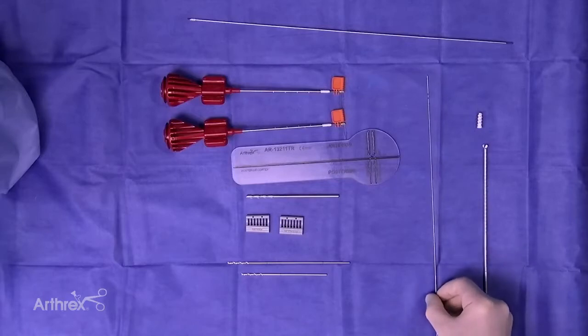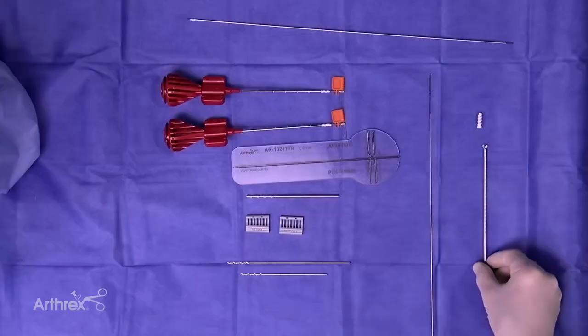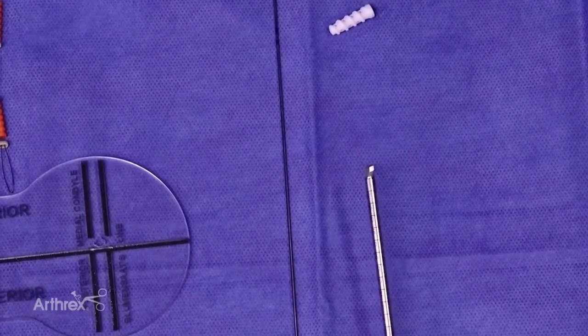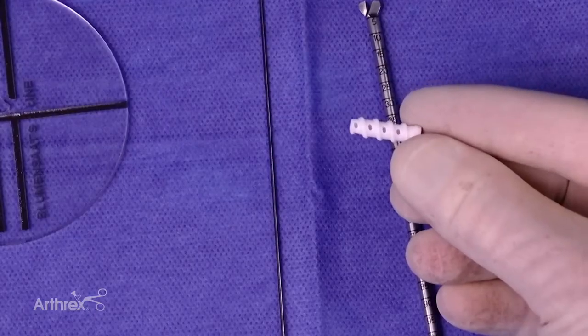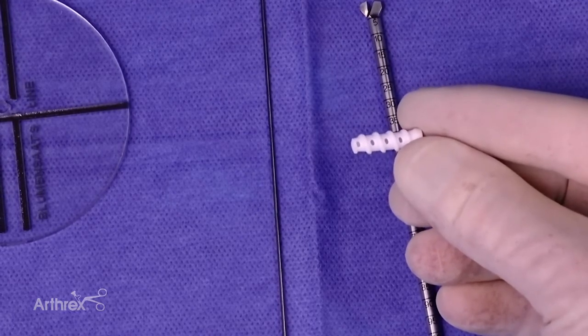There are nitinol wires for passing alongside your drill pin after you find your isometric point. Here's our reamer in the kit — a 7-millimeter diameter low-profile reamer for creating the femoral socket. Then we have the new fixation screw, which is a biocomposite fast-thread, 6 millimeters diameter and 20 millimeters long, for your femoral graft fixation.